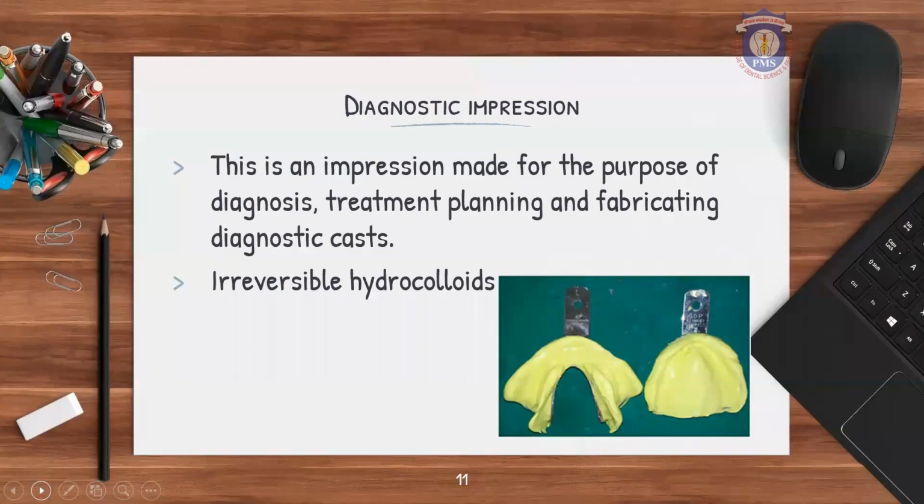Diagnostic impression. From the name, diagnostic. This is an impression made for the purpose of diagnosis, treatment planning, and fabricating diagnostic cast. The materials used here are irreversible hydrocolloids.